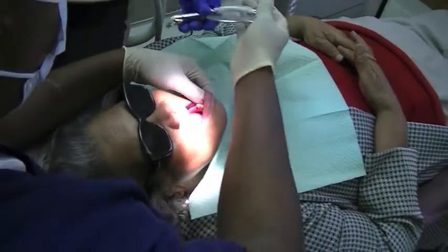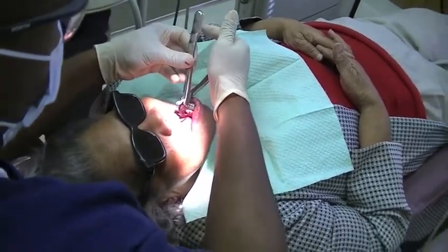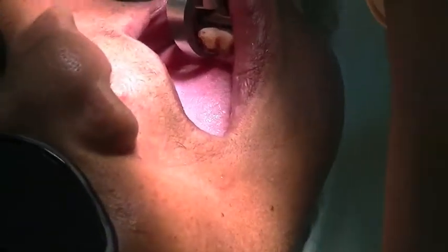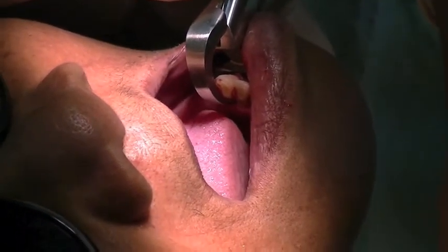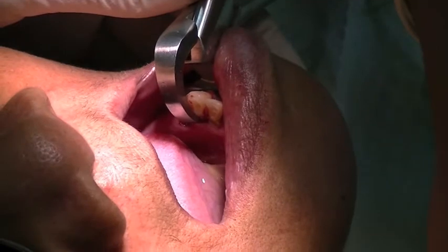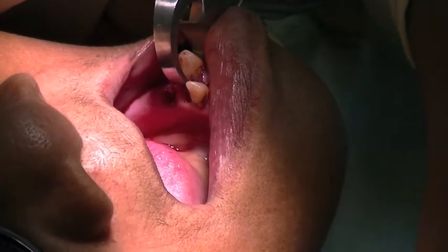Let's see the forceps again. Applying the beak lingual aspect. Bumper as low in the vestibule as possible. Hand position. And just rotating the wrist. And at this point, just be prepared, be patient. We've got our tooth moving. There we go.